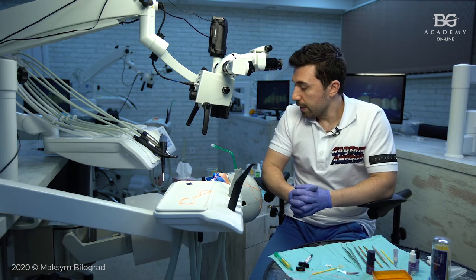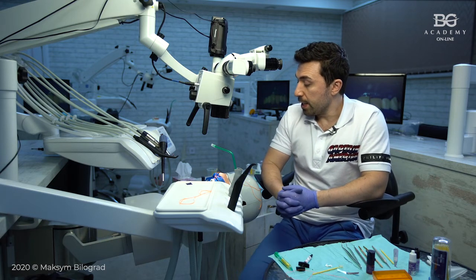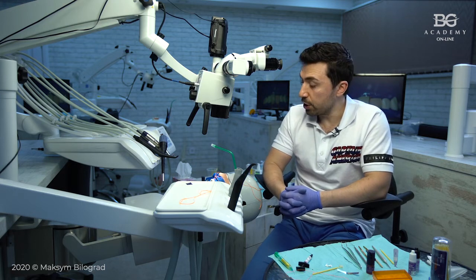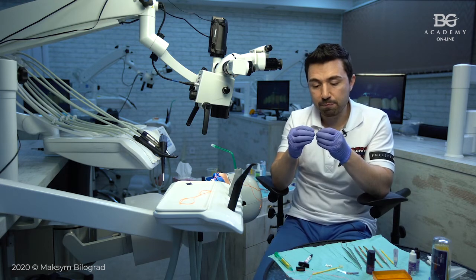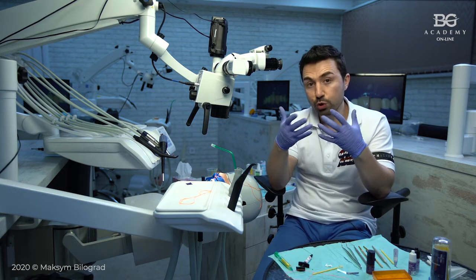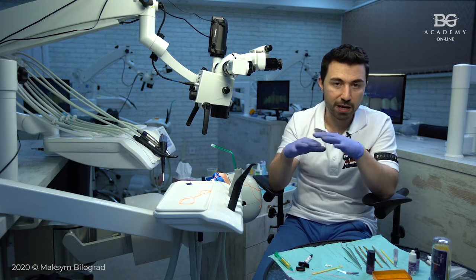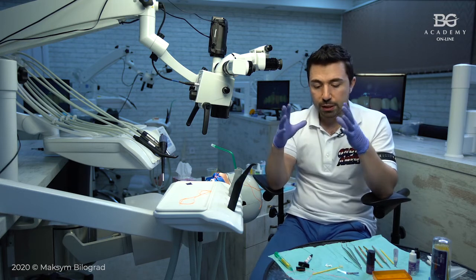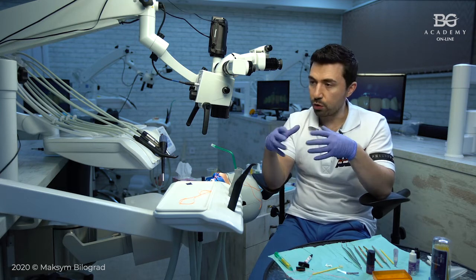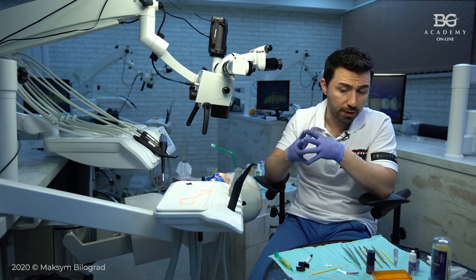Okay, what else? Another thing that you have to admire and respect is that after cementation, especially when you have some problems of marginal fit in some areas, if you use highly flowable composite and then polish it, everything will be fine. This area will be polished and will be fine. To be safe, as I mentioned at the beginning, it's better to use the same or a similar shade of material as the shade of your ceramic veneer.